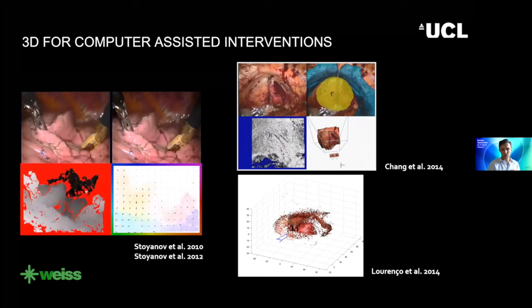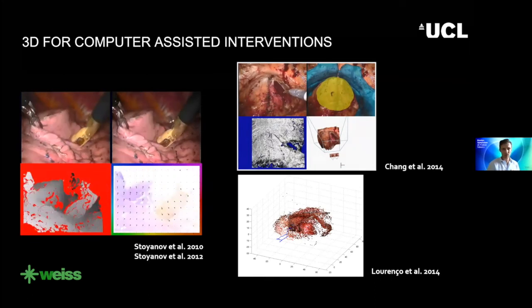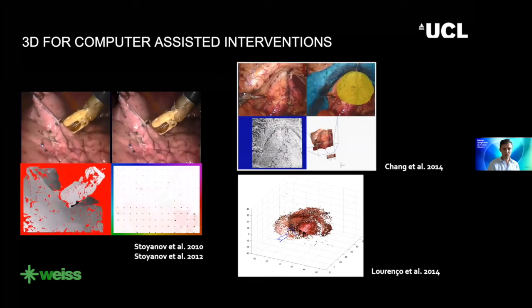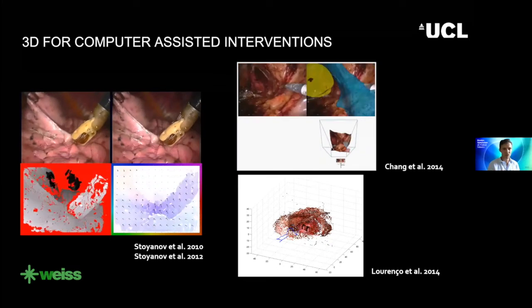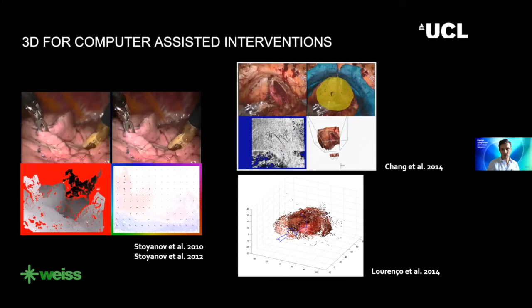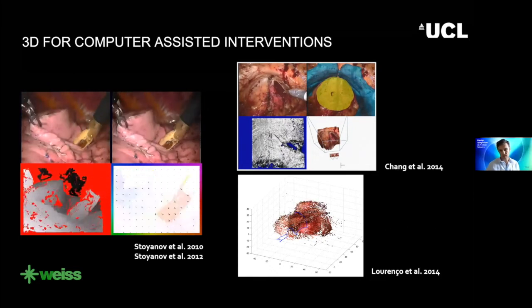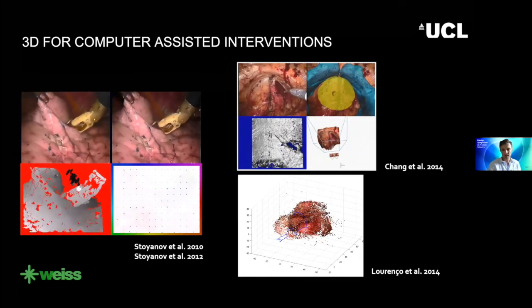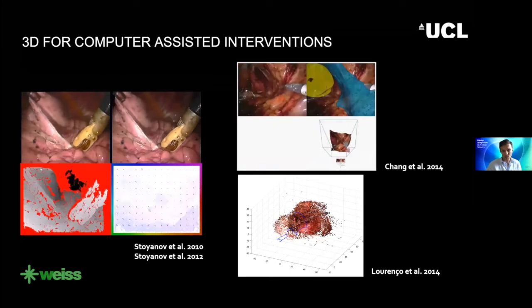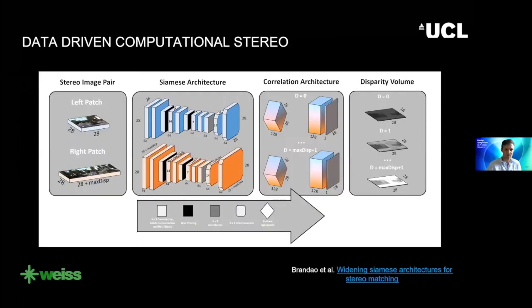So we model the problem, we model the similarity metrics that we're trying to compute, and then we take images and essentially execute these algorithms over them in order to infer 3D information, camera motion, and so forth. And of course, vision over the last 10 years has changed dramatically from model-driven vision towards data-driven vision. And deep learning has really allowed vision to become so much more robust than what we were able to do previously. And we've also adopted this trend. So this is some work published a couple of years ago where we start using deep learning to perform computational stereo on the surgical images.